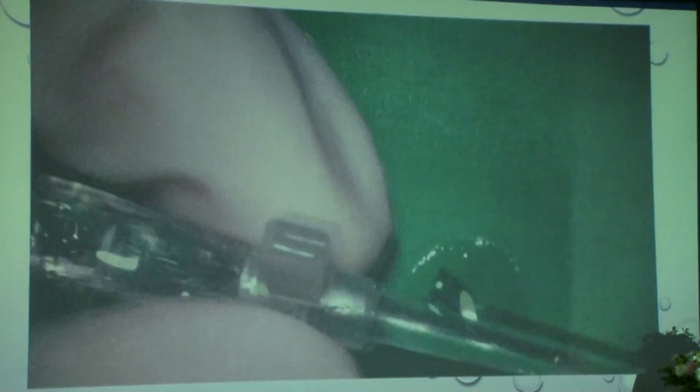Now it's a pull mechanism, so you use a special forceps, you go in and you try to pull. So it's both the movements. You take the forceps, pull it this side, and you take the cartridge on the other side so that it comes to the nozzle. You also have to see at this point that there's a central hole which can be seen exactly from over the top. Following this, you just put it into an injector and you're ready to put it in the eye. So the loading part has to be done before even draping the patient.